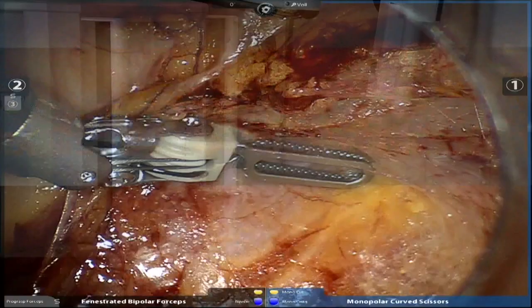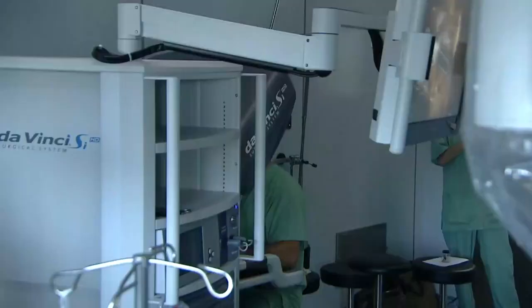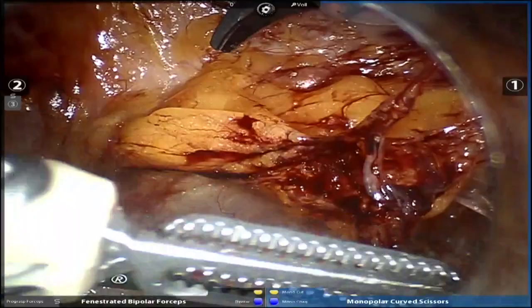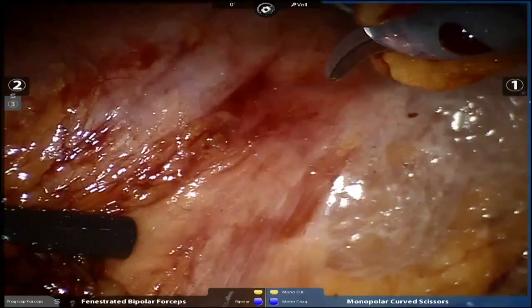So the first thing I'm going to do: right now when you get in, the space seems very small, and it is small. But what you end up doing the whole case is pushing things away from you. This is the posterior body wall here. This is the psoas muscle here. This is the quadratus lumborum muscle here. So what I'm going to do is start back here first, and I'm going to push Gerota's fascia away from the scope. You see? This is Gerota's fascia right here. By pushing away, I'm creating more space immediately. We work very hard the whole time to create more space. So there's Gerota's fascia. I'm pushing it away from me, and I'm gaining more space.